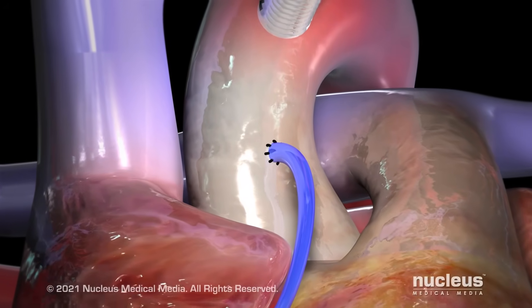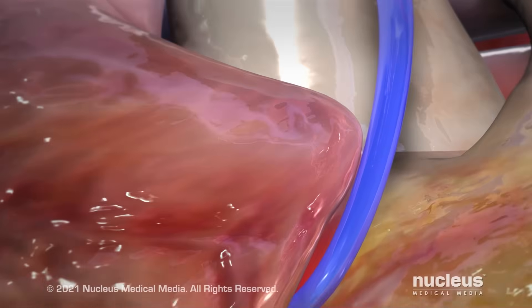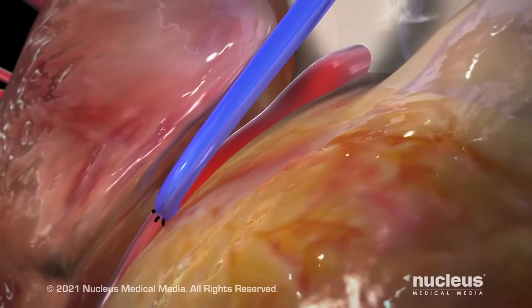For the saphenous vein graft, your surgeon will suture one end to the aorta and the other end to the narrowed artery, just beyond the blockage.